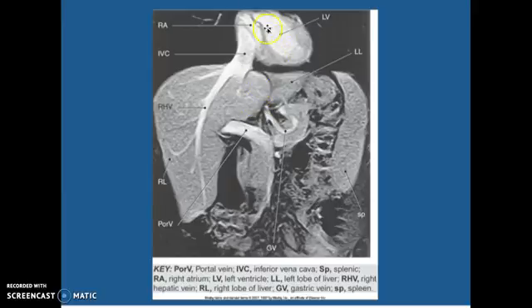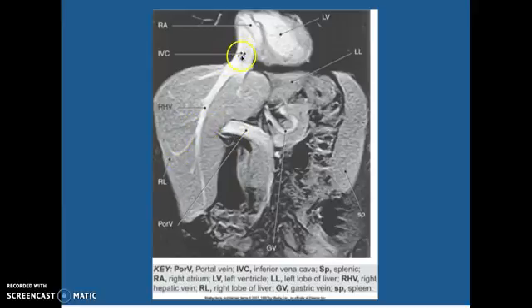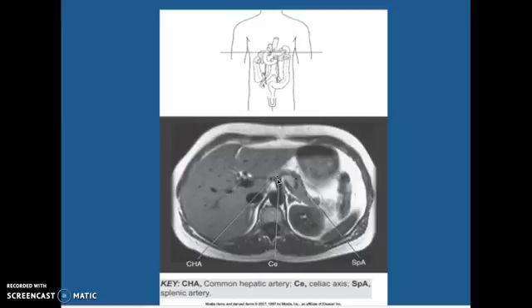Here's your left ventricle, and here's the left lobe of your liver. Coming down, this is your portal vein right there, and this is your right lobe of your liver. This is your right hepatic vein and your IVC. The splenic artery has the curl to it. This is your celiac, so this is your aorta with your celiac coming off, and then your common hepatic artery.